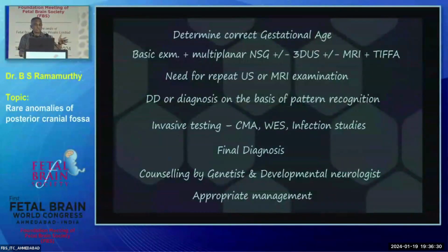So to conclude, determine correct gestational age, because without gestational age, you can't do any of your measurement referencing. Basic examination, if there are any anomaly or changes or departures from normal, move on to multiplanar.